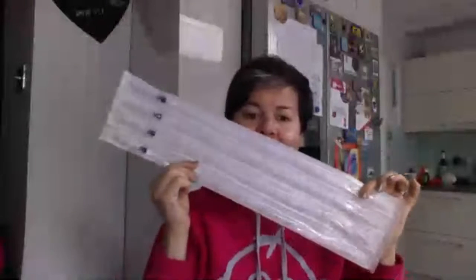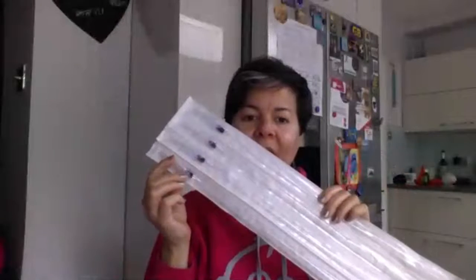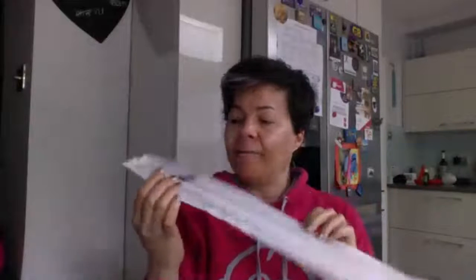Suctioning involves using catheters, which is what this is. As you can see, our catheters are purple because they're a size 7. Zoe has what is called a 3.5 neonatal bivona. She has never been upsized and she never went to a pediatric tracheostomy because she's so stable on what she has. The pediatric one is only different in that it has a couple of millimeters longer length on it to stop it from coming out quite easily.